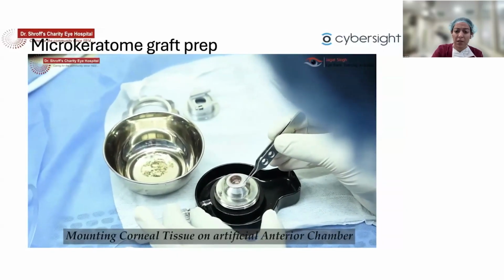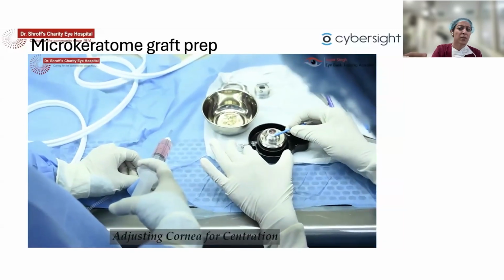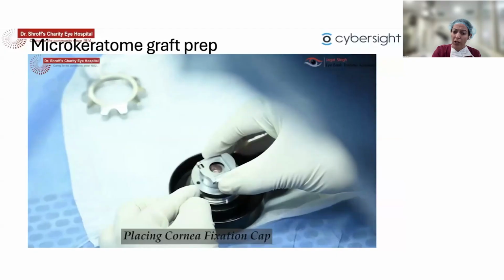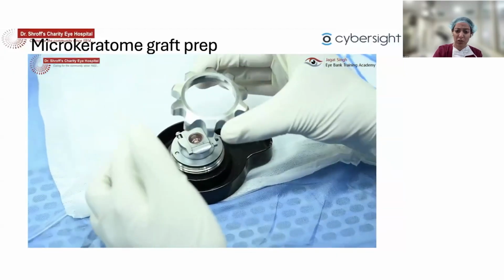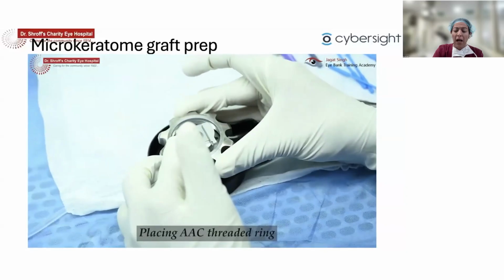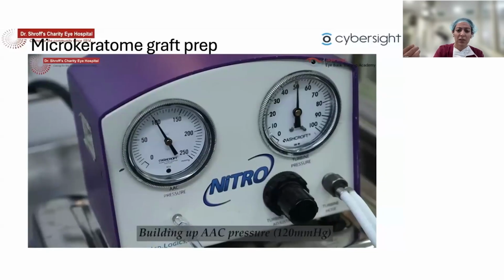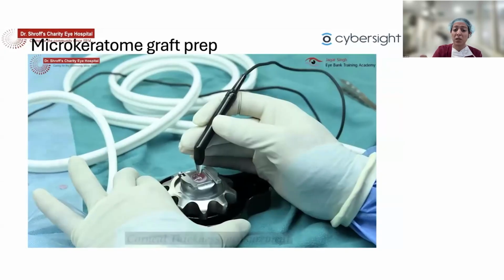The tissue is mounted similarly on an artificial anterior chamber. Maintain adequate pressure on the machine. The tissue is locked in with a cornea fixation cap and then the screw ring to lock it in position. After this threaded ring is placed in place, we check the fixation, the instruments, the pressure in place, check the eye pressure because this has to be taut.